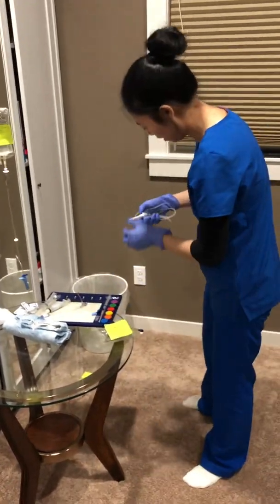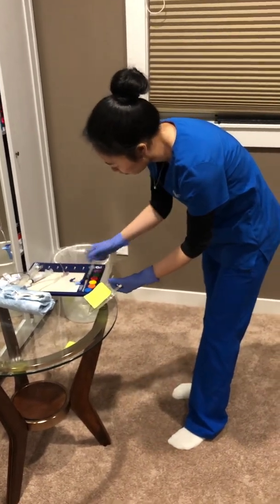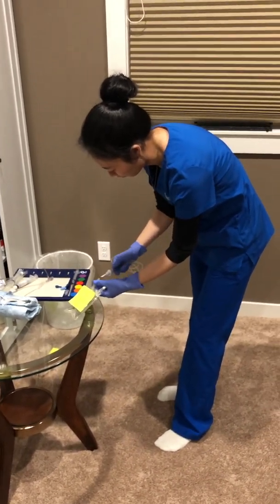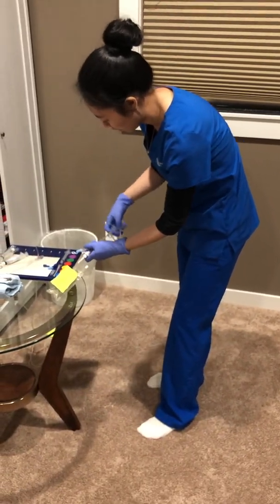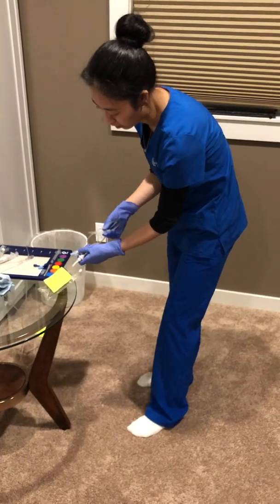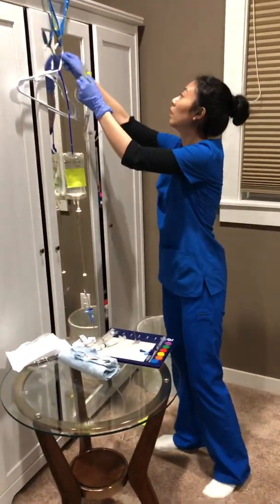And then I'm going to open this one sterile, give it the medication, and make sure the clamp is already clamped. This is already clamped, so no medication dropping.